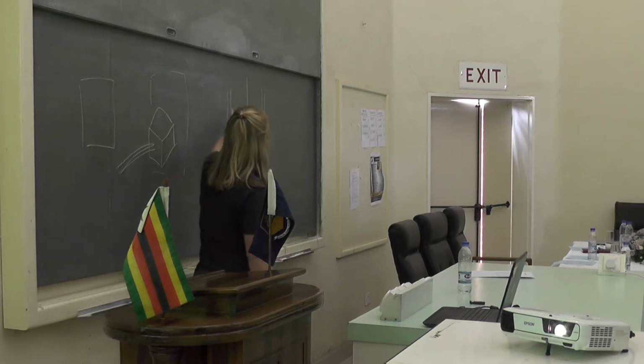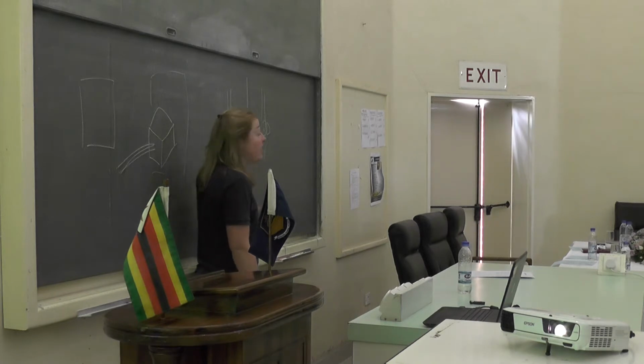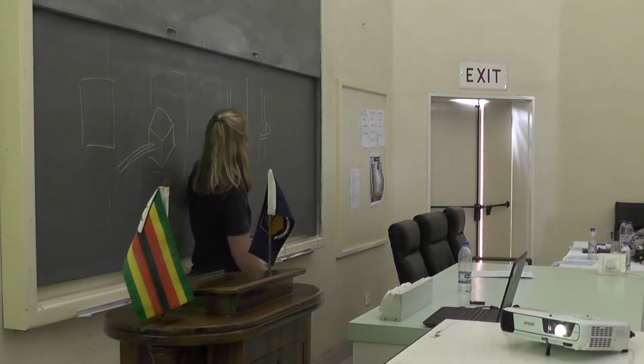So you have your first phalanx and your metacarpus or your metatarsus, and these 2 are the sesamoid bones. And in this view, you're looking at the joint space. So this is beautifully open. You can look for any pathology, any little fragments. Great. But what if I wanted to look at a sesamoid bone?